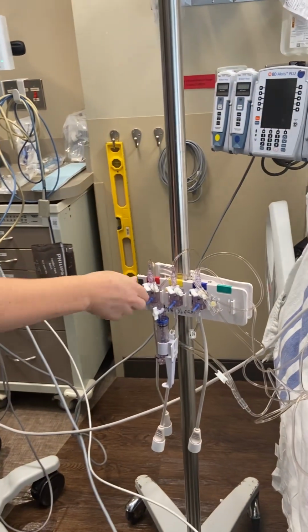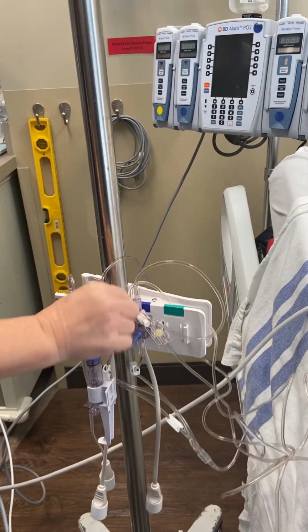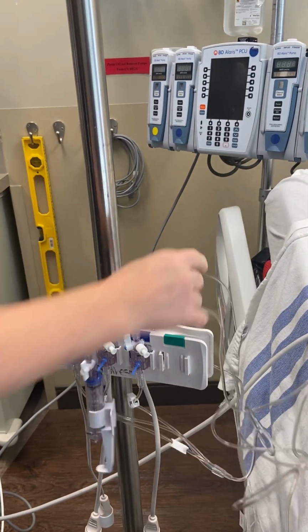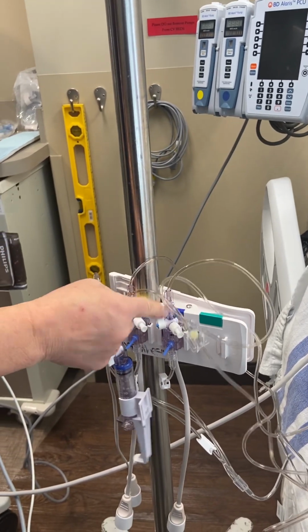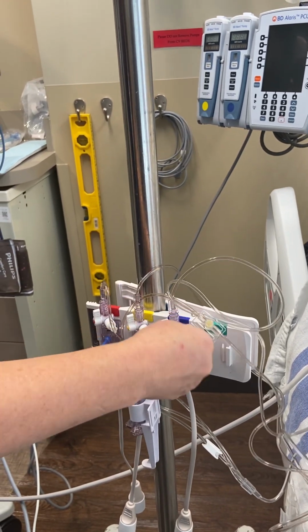Once you have all that, you can zero now. So you turn your stopcocks away from the patient. So always remember, up is off to your patient. So you remove these caps.